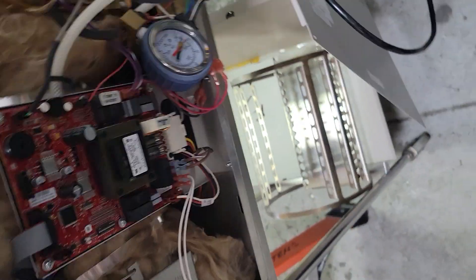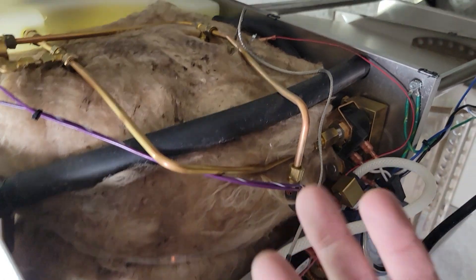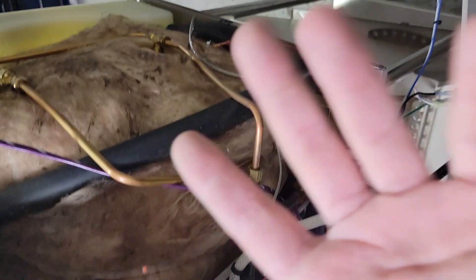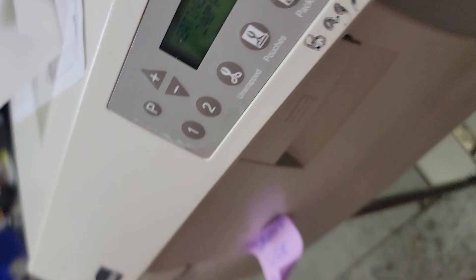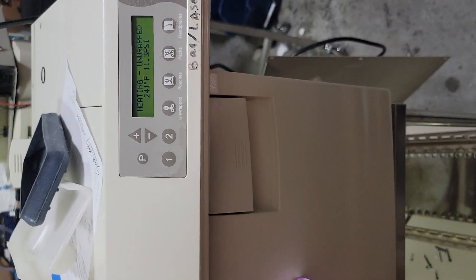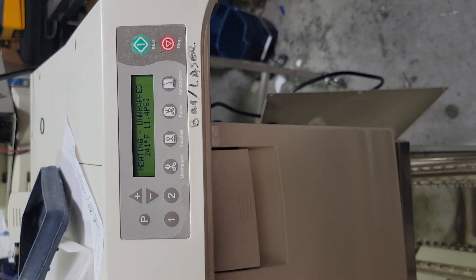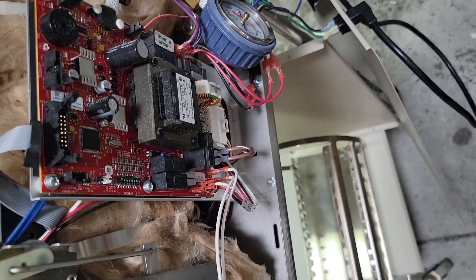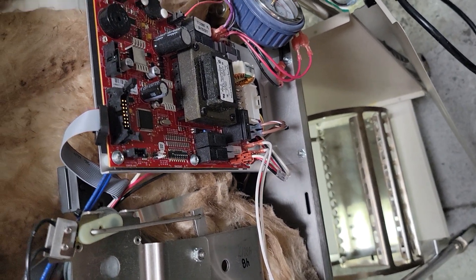By the way, this insulation — you should not touch it by hand. It's usually fiberglass — microscopic tiny slivers of glass. You don't want that in your skin. Be careful, and don't touch your face or anything else after handling it. Alright, that's it — the diagnosis was a leaking vent valve. Good luck out there.